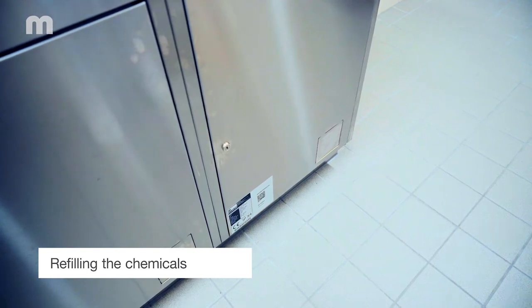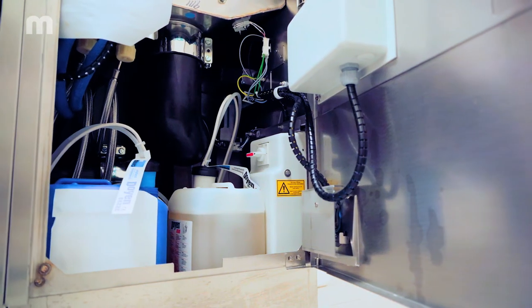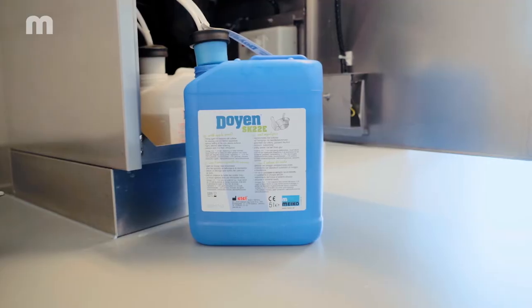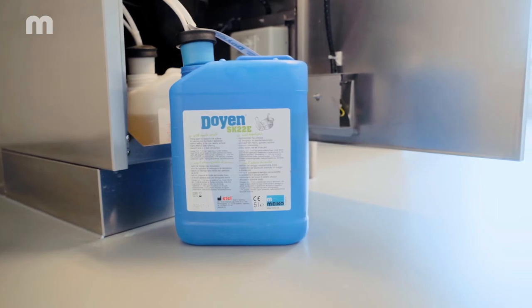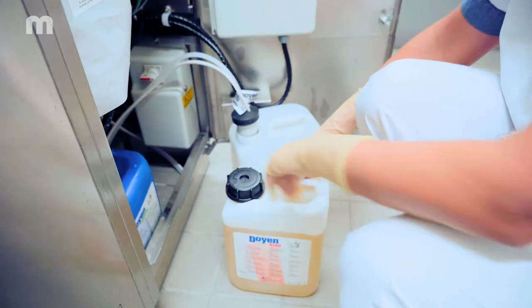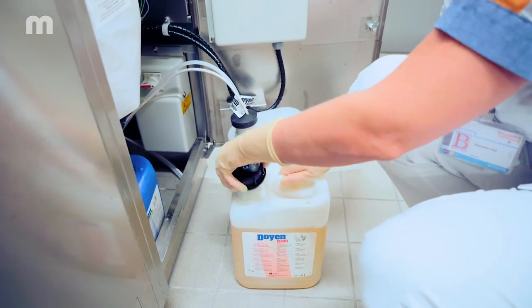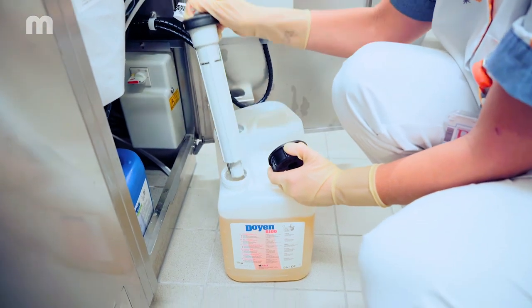The display on the bedpan washer disinfector shows when the canisters containing detergent and/or rinse aid need to be replaced. Please note these liquids are chemicals, so always read the supplier's instructions before using them and take the necessary precautions. Open the door of the compartment where the canisters of chemicals are located. Take the suction lance out of the empty canister and place it into the full one.